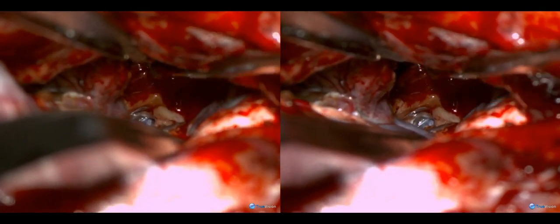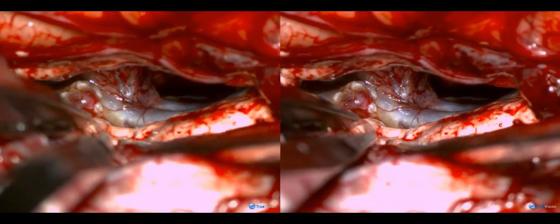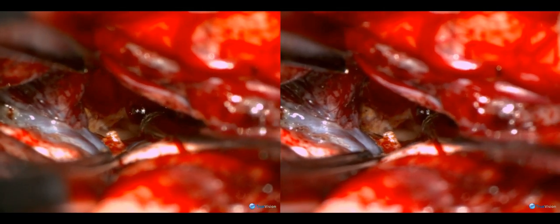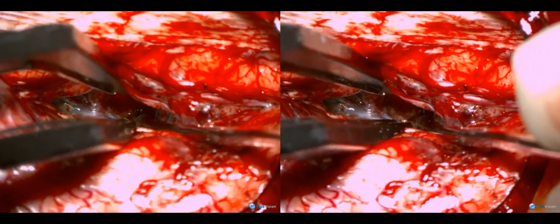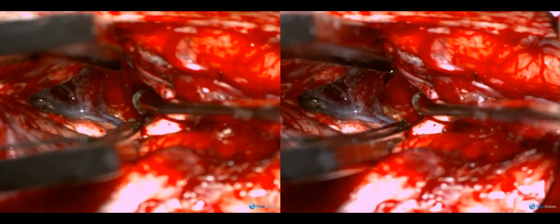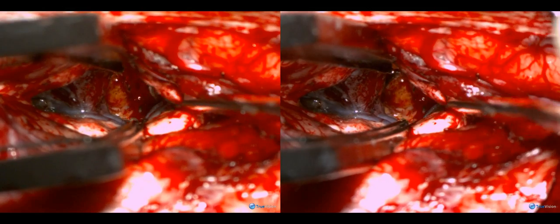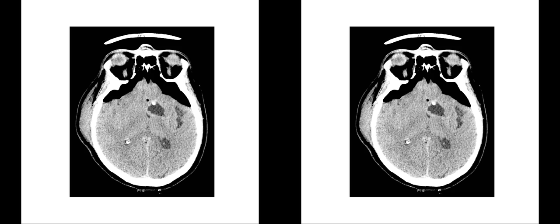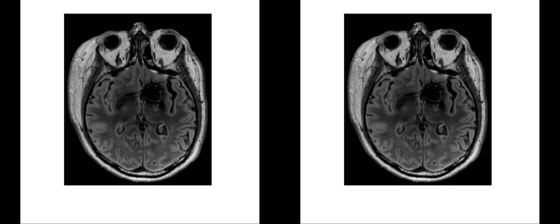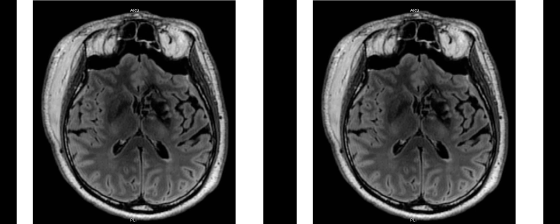This is to prevent any hydrocephalus postoperatively. This shows an overview of the resection cavity with preservation of the venous malformation and complete removal of the malformation with gliotic membranes on all sides. These postoperative images confirm the malformation has been completely resected. The patient recovered well from his hemiparkinsonism and his cognitive deficits also improved.